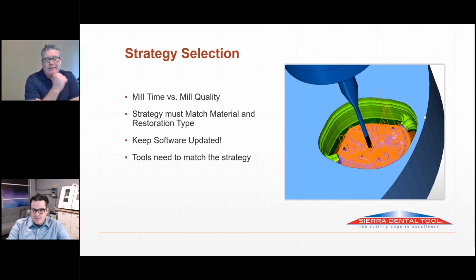Greg was telling me the other day that he took a call about a customer who's breaking tools. He broke 6 of them. What's going on? Your tools are horrible. Greg logged in and noticed that the overall geometry of the tool didn't match up. You remember that? Yeah, this actually comes up pretty often, and it's because laboratories don't update their software.